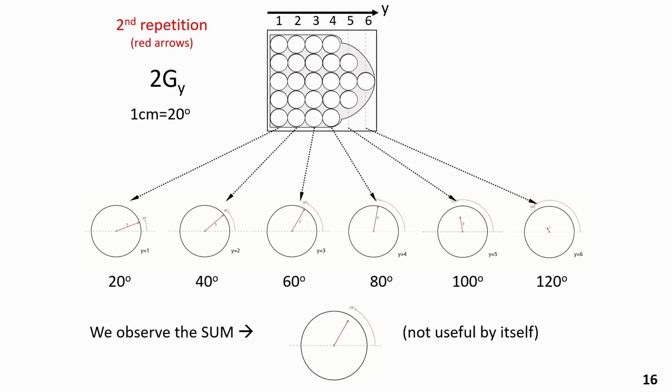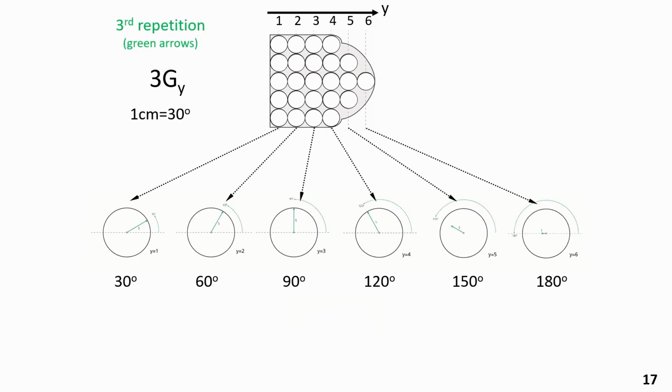Again, the red vector sum by itself is useless. However, we take a photograph of it and we store it. When we're done, we ask now all drivers to go back to the starting line and this time to increase their speed for the same short period of time as before, but now triple speed. When the short period of time of triple speeding is over, we see increased phase accumulation from left to right with green vectors.